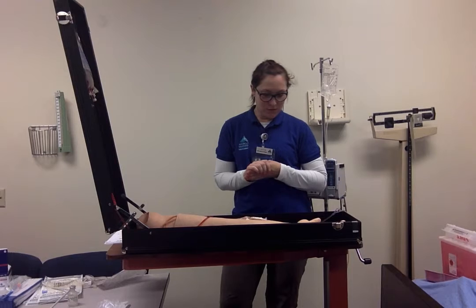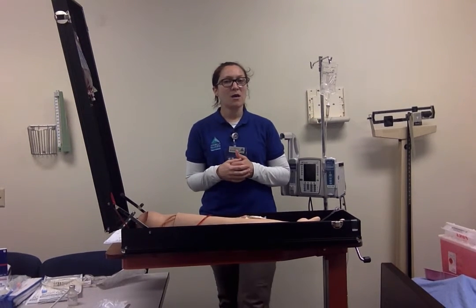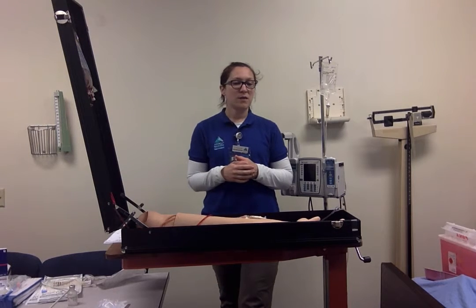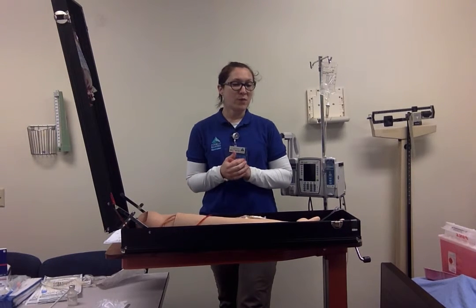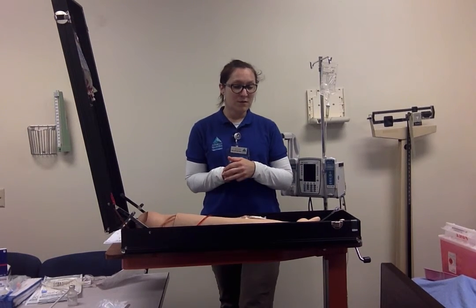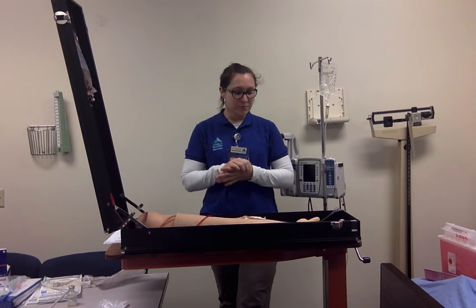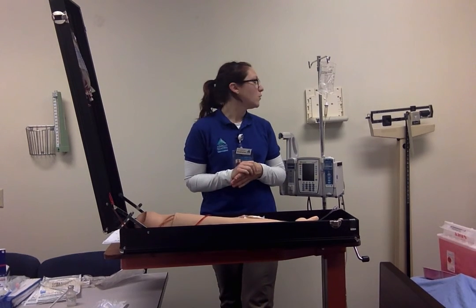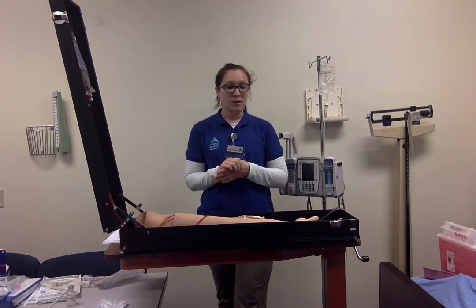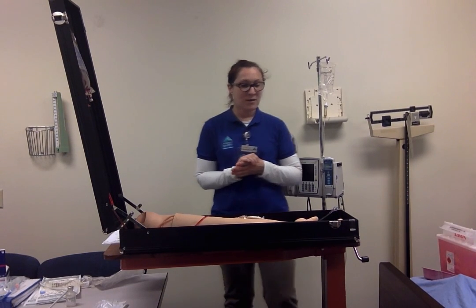Then I will go to the MAR. I'm going to make sure that I record the date, the time, the drug that was administered, the rate of the infusion, the condition of the site, making sure to document that there was no phlebitis or infiltration, and also making sure that I record the volume of the piggyback fluid. Once all that's done, I am good to go.